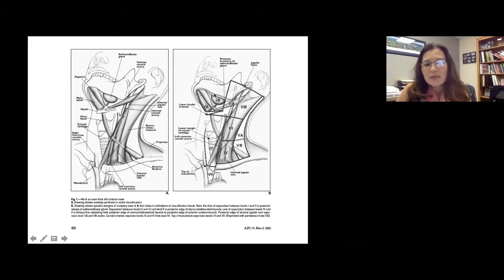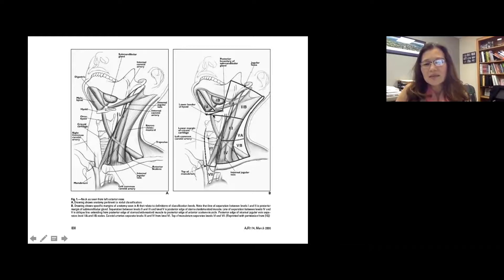Here is the submandibular gland, anterior belly and posterior belly of the digastric muscle, which is also very critical to look for level 1A and 1B nodes. The neck runs from high to low neck, and that's divided by certain anatomical structures, including the bottom of the hyoid bone, which divides zones two and three, and then the bottom of the cricoid cartilage, which divides zones three and four.